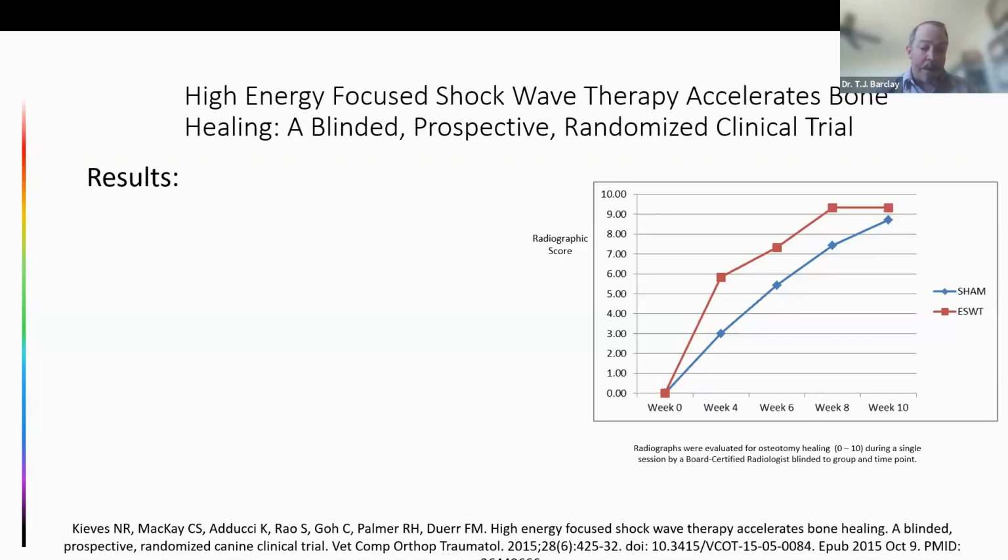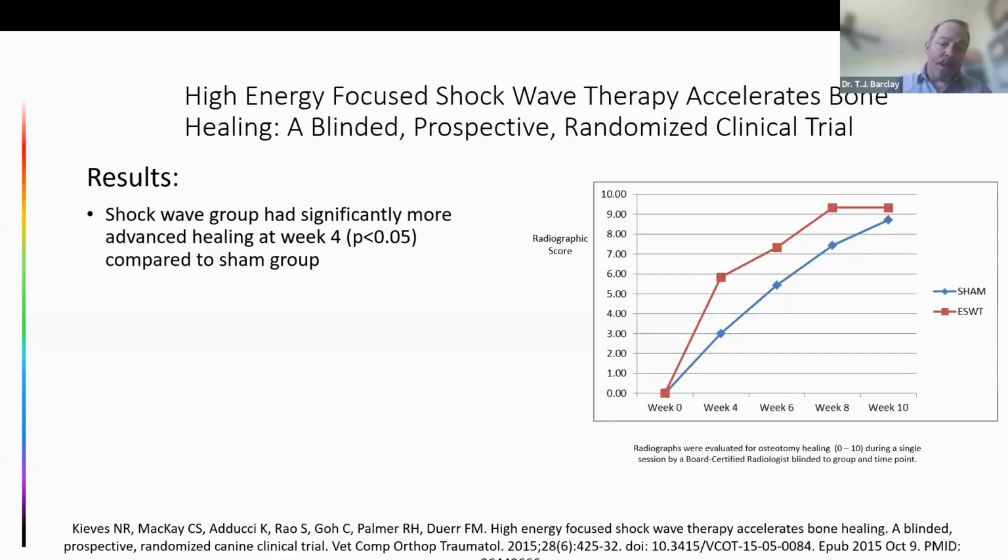In total, there were about 44 stifles enrolled in this study, and the shockwave treated group showed significantly more healing at the 4 week phase.